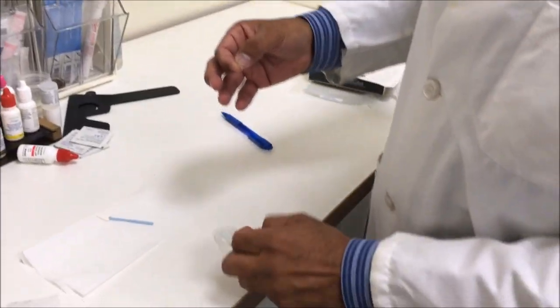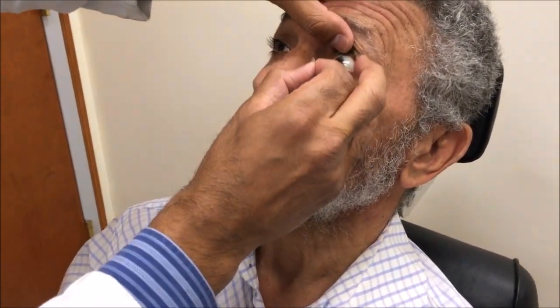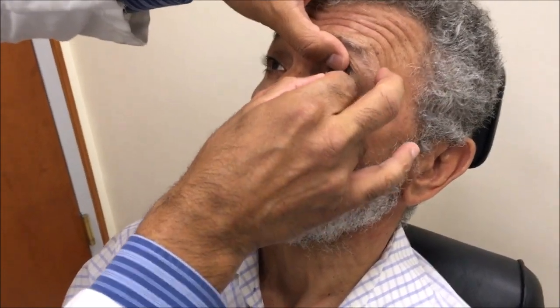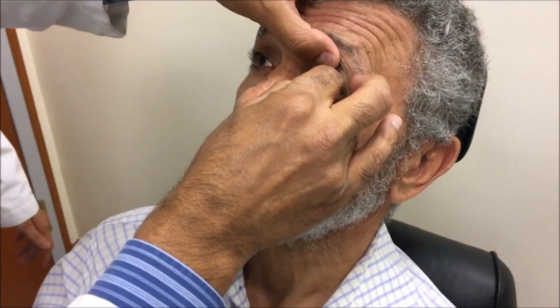Let's give it a go — we also have our soft contact lens ready to go. Okay so there's my speculum basically — I'm holding his eye open. I'm giving him a target to look at which is my eye, and as long as he's looking at my eye I can see if he's in the right position or not.